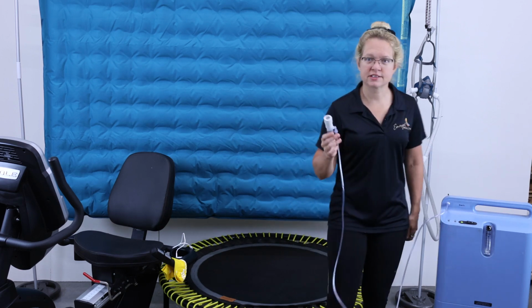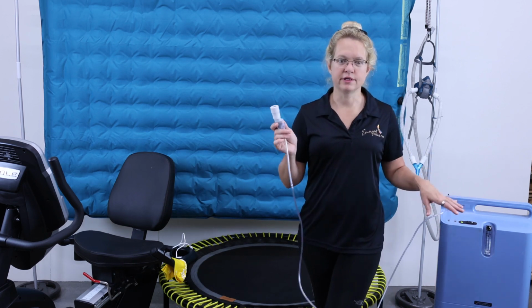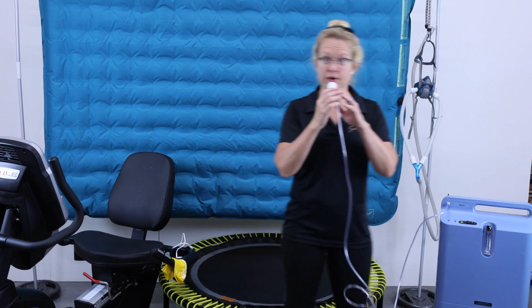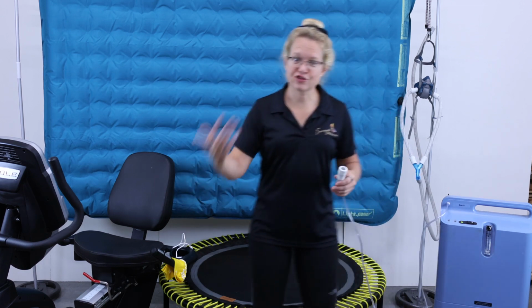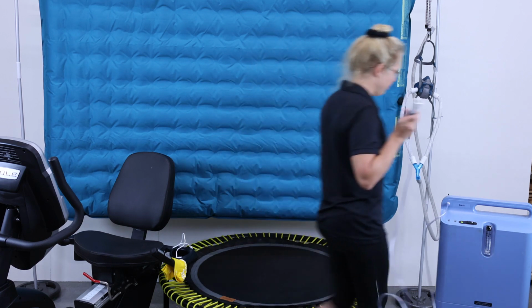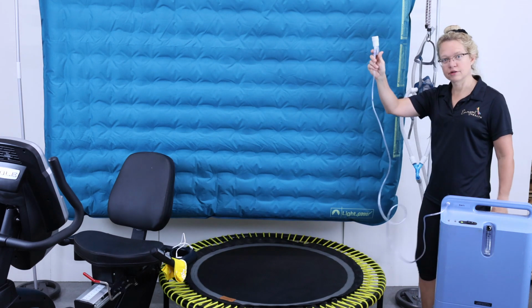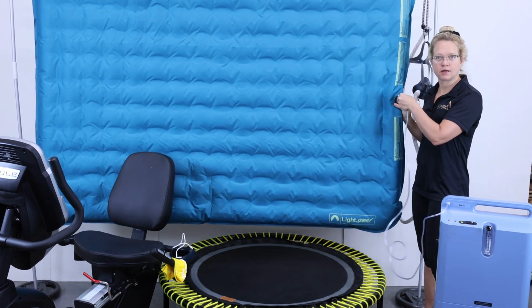And it takes a while. It's not really quick. I can't remember how many liters per minute this one creates, but it's not fast enough to breathe directly out of. That's why you have a reservoir, because when you're exercising, you're going to breathe more than this can create. And so then you take your attachment and you attach it to your air mattress.